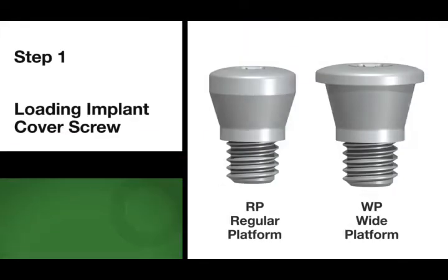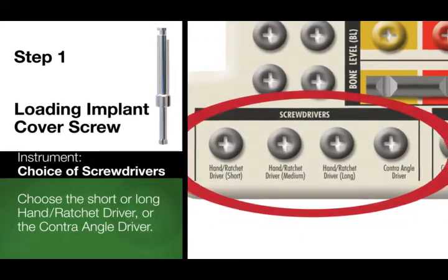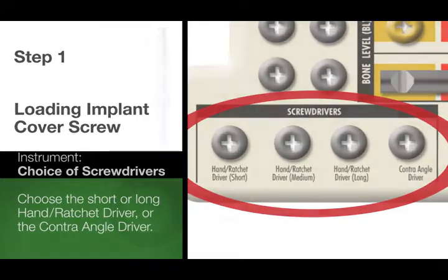Infinity OCTAGON single-stage healing preparation. Step 1. Loading the implant cover screw. Choose one of the 4 OCTAGON screwdrivers included in your surgical kit. You can find them in the bottom left side of the tray.